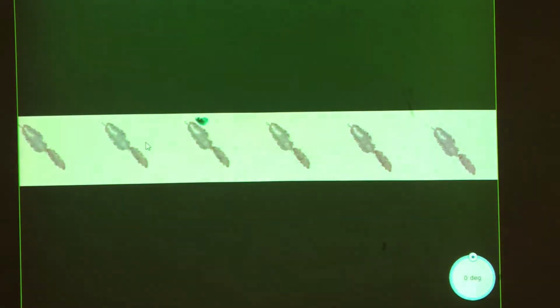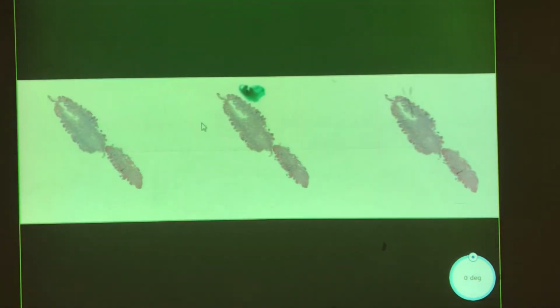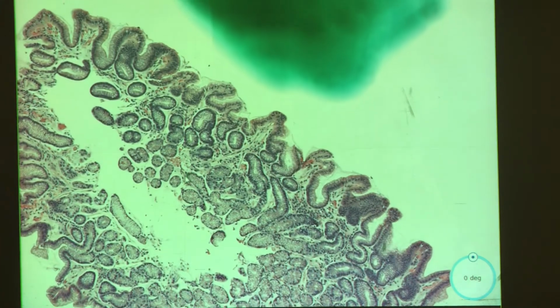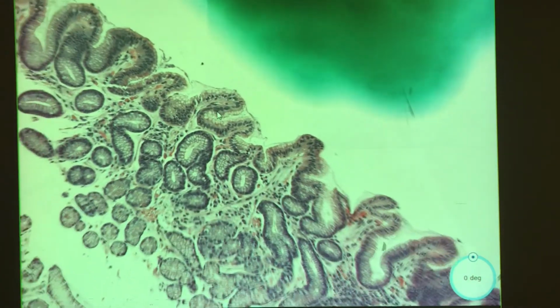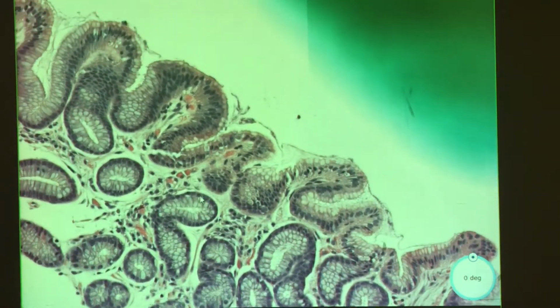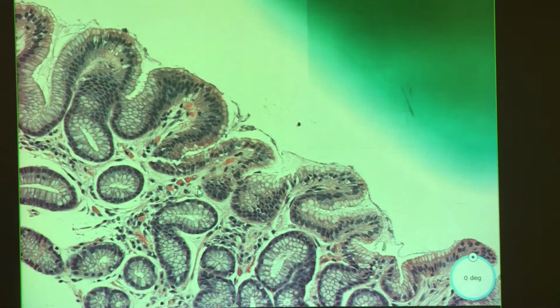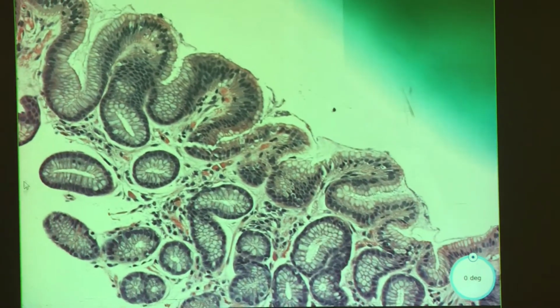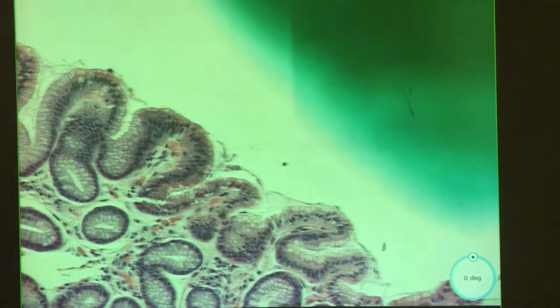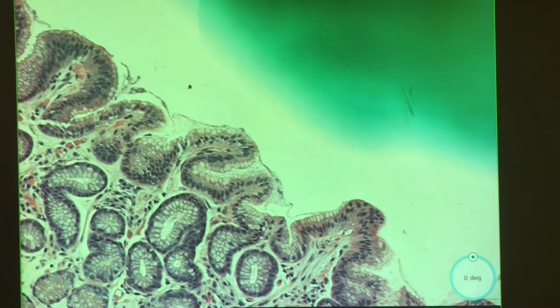Okay, the stomach. Biopsies, I see a duck, so let's focus on that. I like ducks. Okay, first you determine the type of mucosa here. This kind of looks like antral type mucosa. Not really seeing any pink parietal cells and purple chief cells.